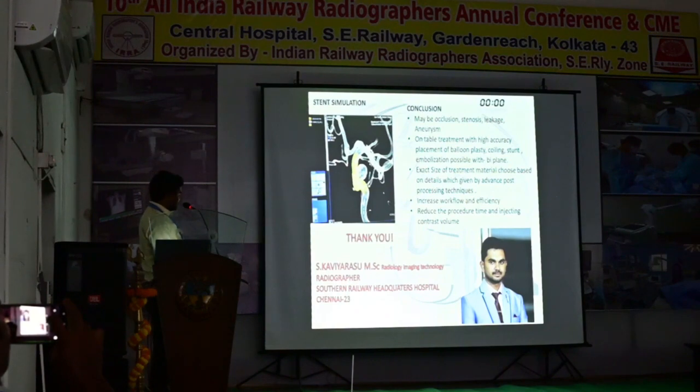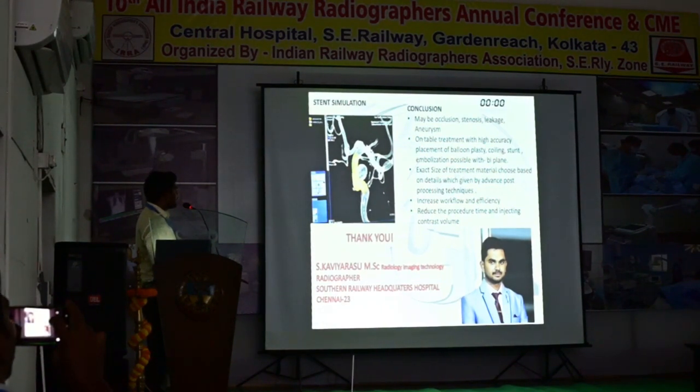Conclusion: in our afternoon first session, the operating strategy showed a lot of stenosis and aneurysm images. For such patients, more accurate treatment with biplane DSA is possible. The exact size of treatment material can be chosen based on the measurements given by advanced post-processing techniques. It will improve workflow and efficiency and reduce the procedure time and injected contrast volume.